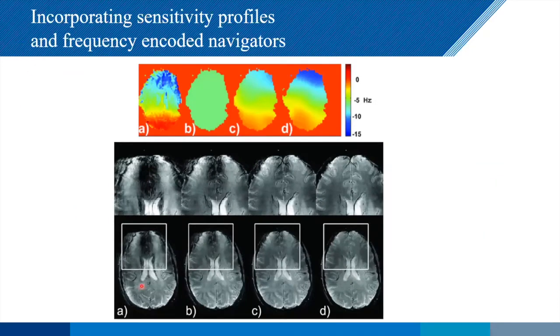So here's with no correction over here. We apply uniform correction. We apply one here that is just based on the receive array. And here we actually put some frequency encoding information. So it's a 1D plus the receive array. And you can see you can go from really a horrendous image over here with artifacts to almost complete recovery of the information over here. So put everything together and you have a system that can potentially be used clinically.